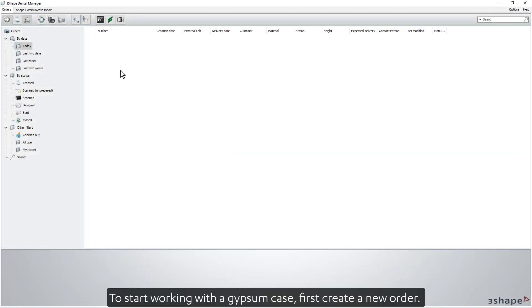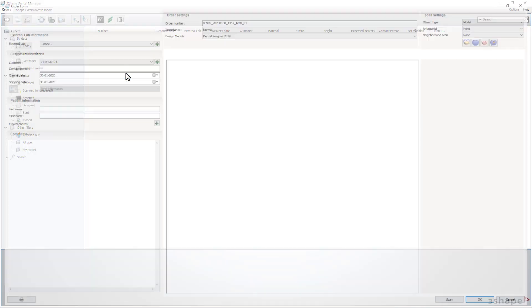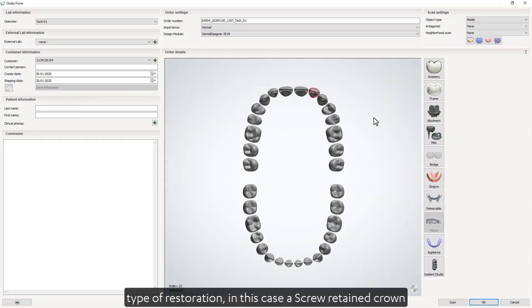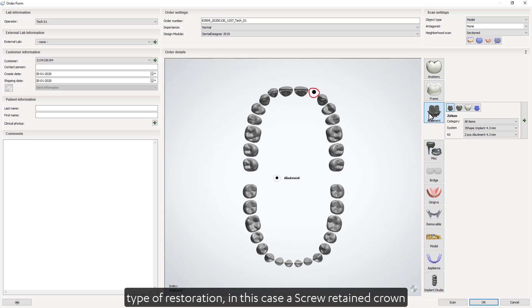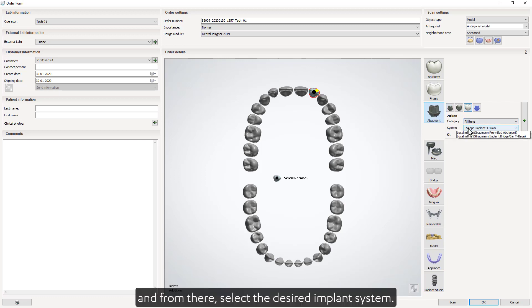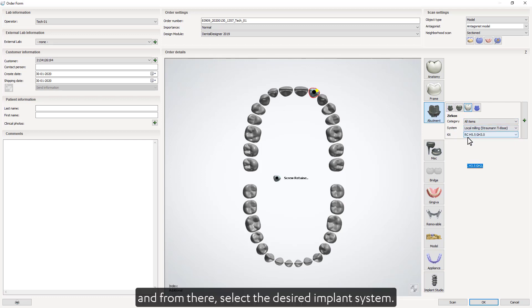To start working with a gypsum case, first create a new order. Select the tooth, type of restoration — in this case a screw retain crown — and from there, select the desired implant system.